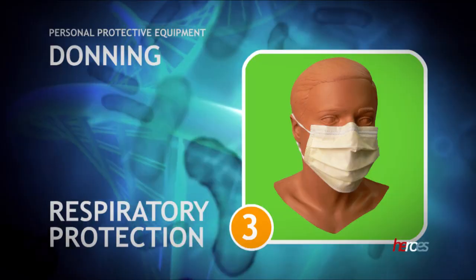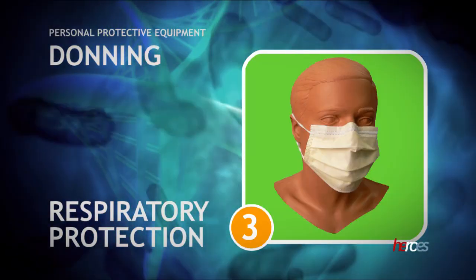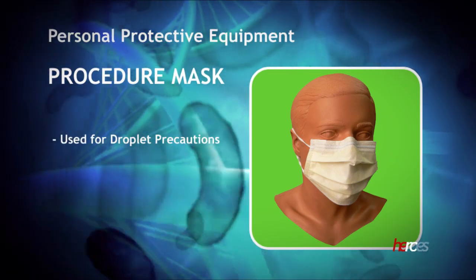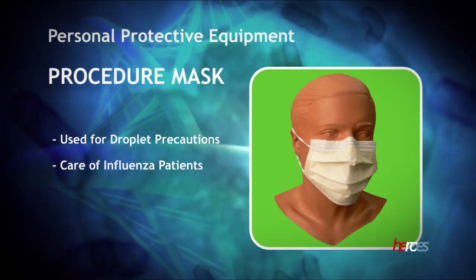The third step is the selection of respiratory protection. One option might be a procedure mask. Procedure masks are used for droplet precautions, which are used in the care of patients with influenza.